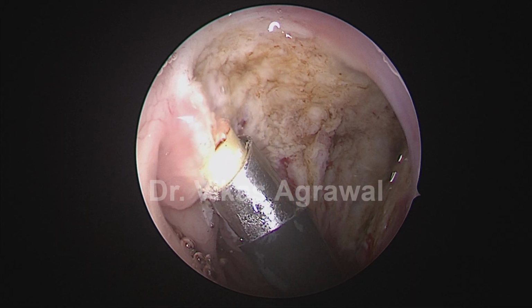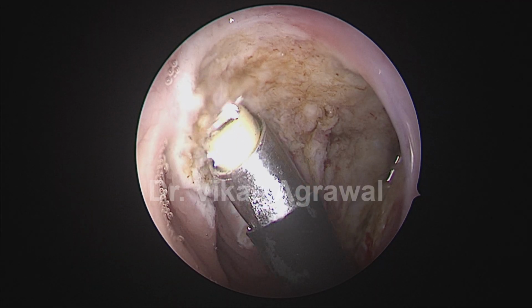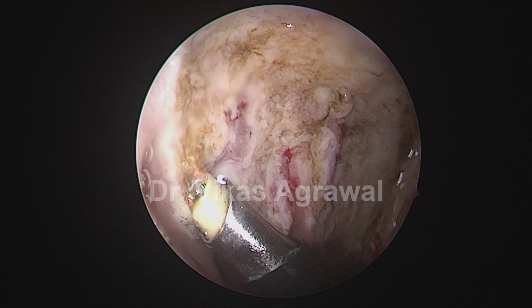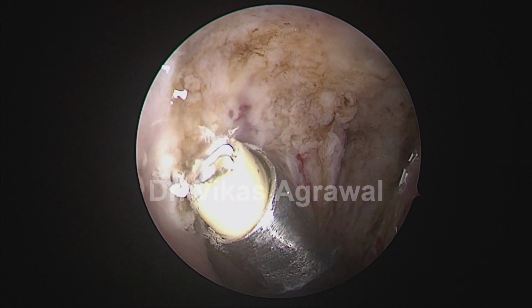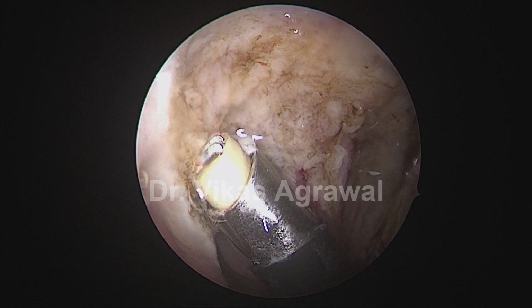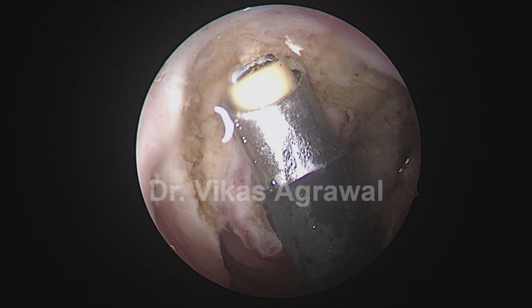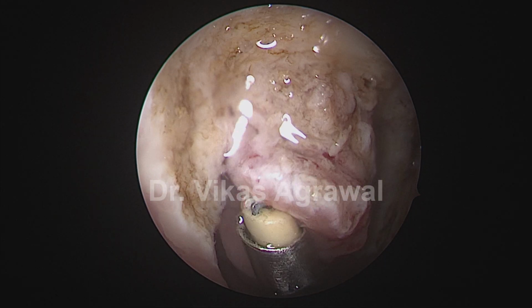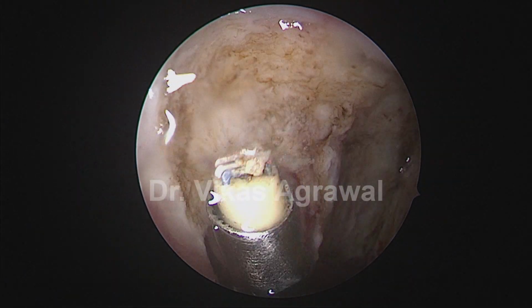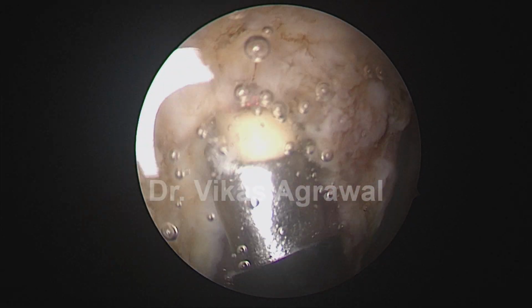And you can see these are all lymphoid tissues. This is the lateral boundary. Torus tuberous, remaining 5 mm away from the eustachian tube orifice. The superior boundary, lateral boundary, and the posterior boundary all will merge into this place, which is the fossa of Rosenmuller.